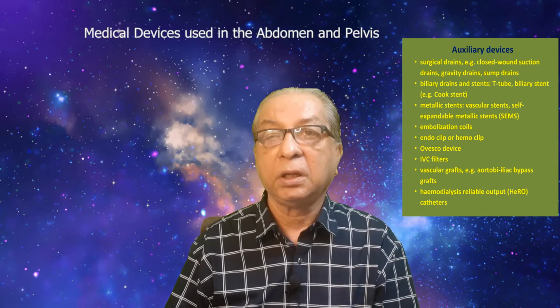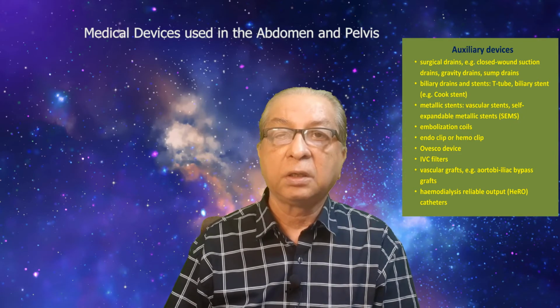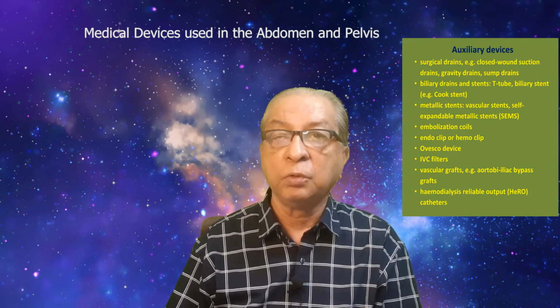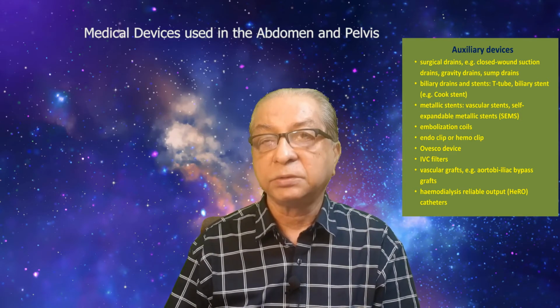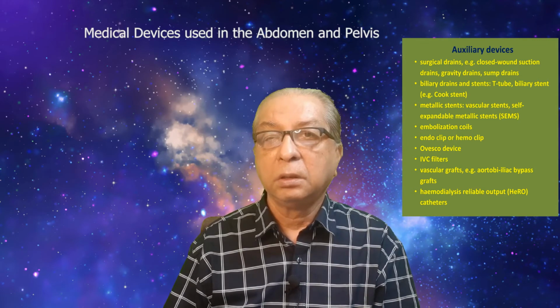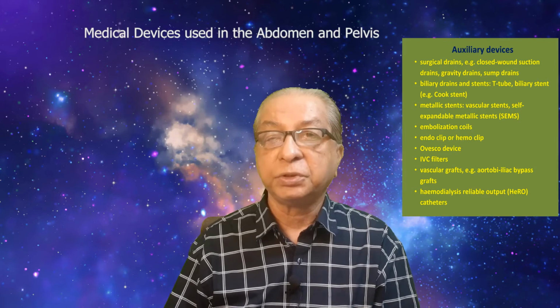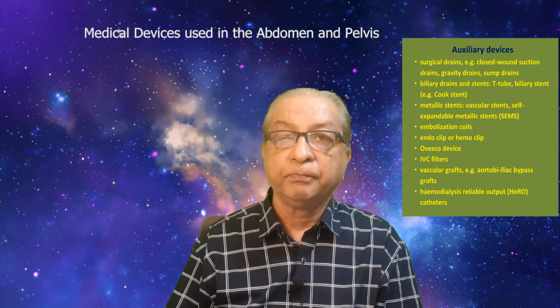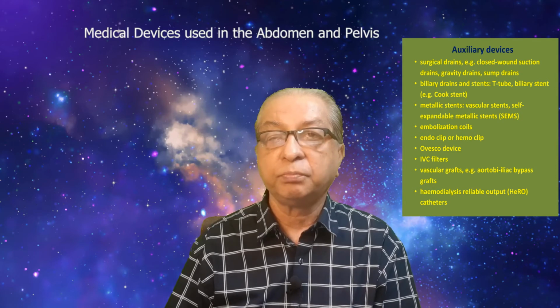Especially the intrauterine device, very commonly called a loop, may migrate, or sometimes it may be covered by connective tissue, and the doctor may not be able to pick it up the way he picks up in a normal patient.